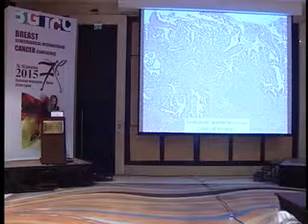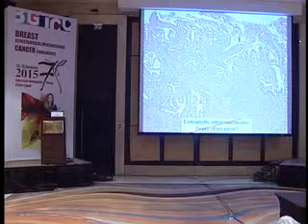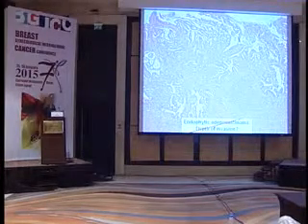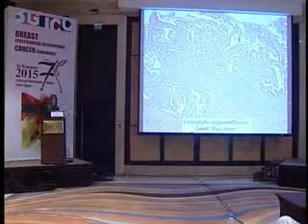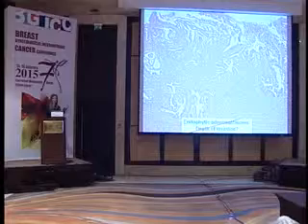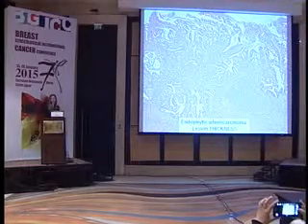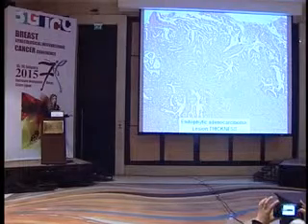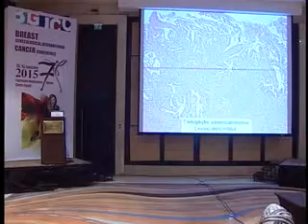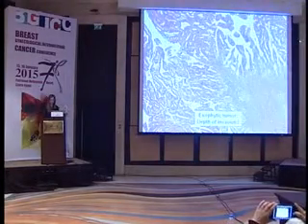The next one, how about this case? Where would I measure from? It's endophytic, it's not exophytic. And would I pull it from the surface down here? Probably, but is this the real depth of invasion? Or is it the tumor thickness? This is the difference between both of them. So I could put the tumor thickness and do the best I could. So this is why we call it tumor thickness. And we have to measure both thickness and the horizontal. And I'll show you why.